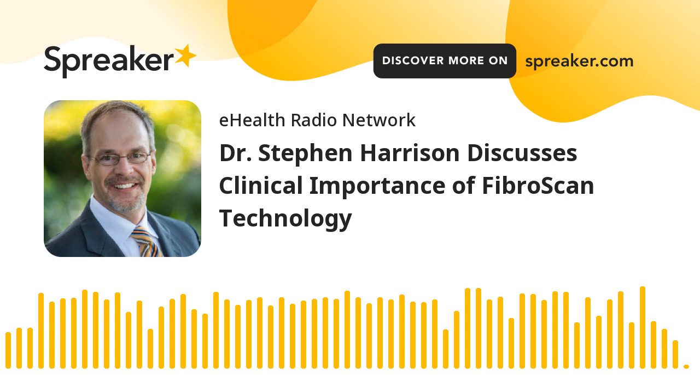So this is a fascinating topic. We are making so many advances on treating fatty hepatitis or NASH. And one of the issues that we've been faced with is when we look at our population of fatty liver, how do we do a better job at really getting after that at-risk NASH population I just mentioned? So we do have the FAST tool to use, that FibroScan plus AST, that blood-based biomarker.